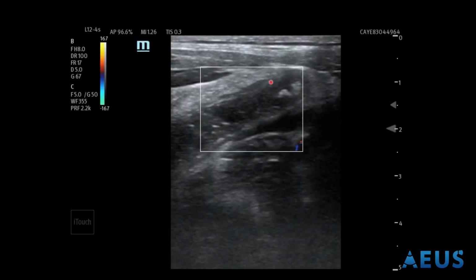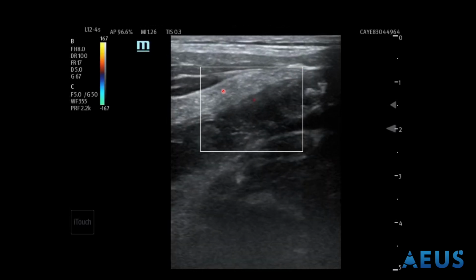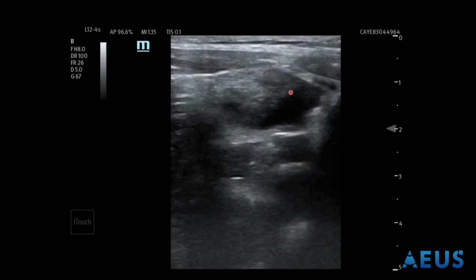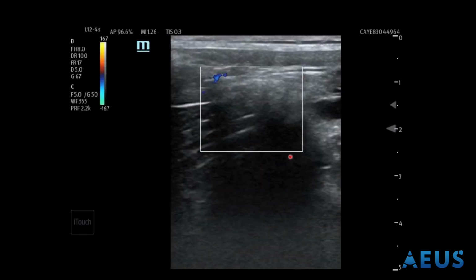Make sure you put some color Doppler. It's not particularly hyperemic. However, we do see some free fluid. Again, this is the psoas muscle, which is another common area that the appendix lies above. And we have some fat stranding over here. Scan through, free fluid, again, seen around, either from a rupture or reactive.